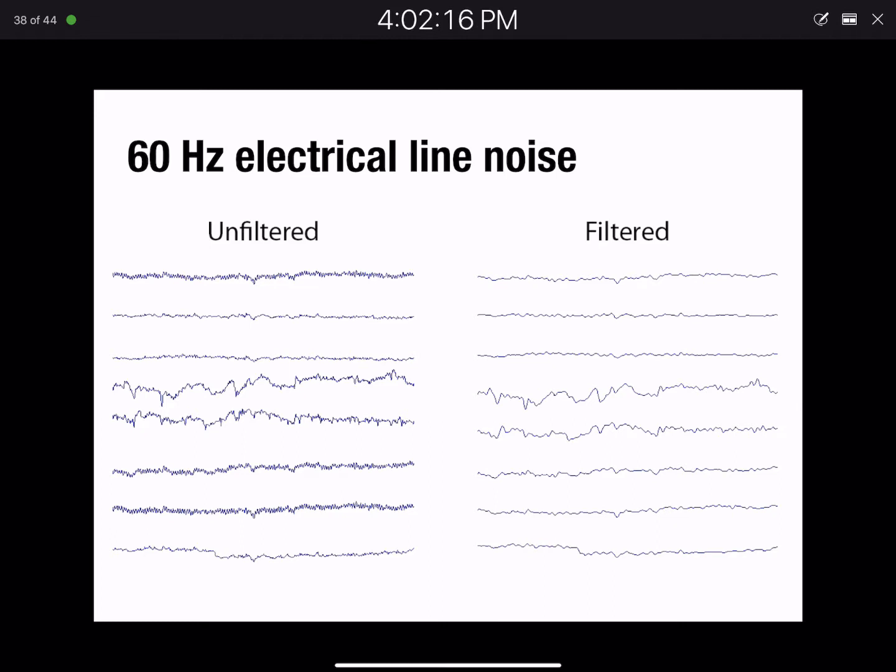But as much as you can do to get clean data at the outset is great, because sometimes the line noise can be really big and can be a little harder to remove. And also when you're recording the data, it's nice to have relatively clean data to look at, so that you can tell when an electrode's impedance starts going wonky or it gets noisy because the person's got some muscle tension. Sometimes over time, somebody's doing an experiment, their neck starts to get sore, or they start to move a little bit. It's nice to know that, okay, that's muscle tension. We can see that because there's not too much other noise in the data. So it's still worth keeping it clean.